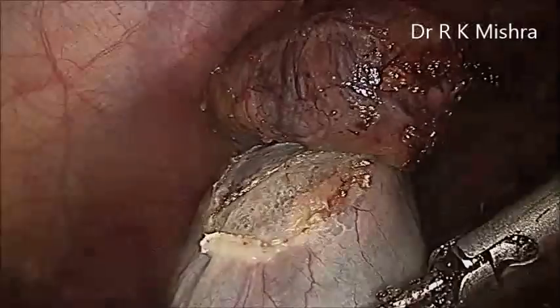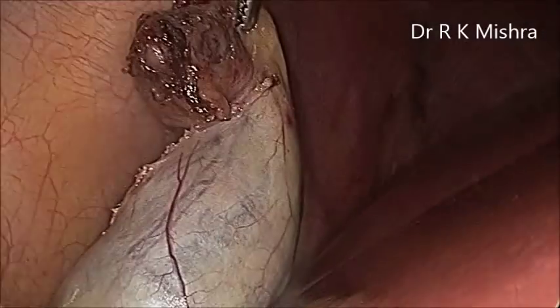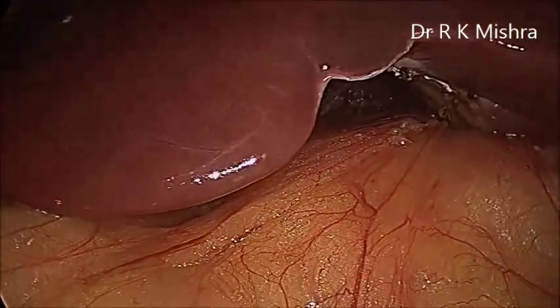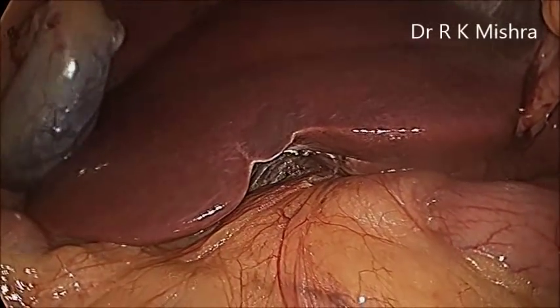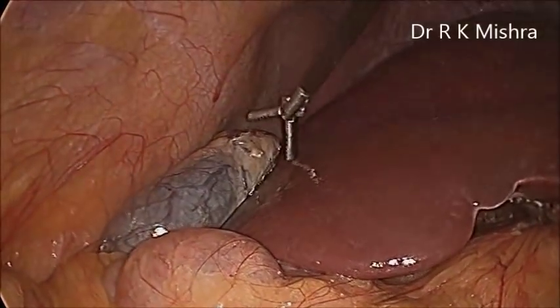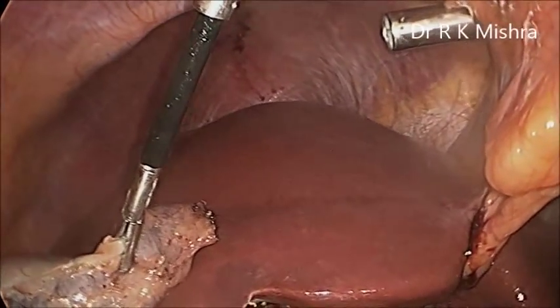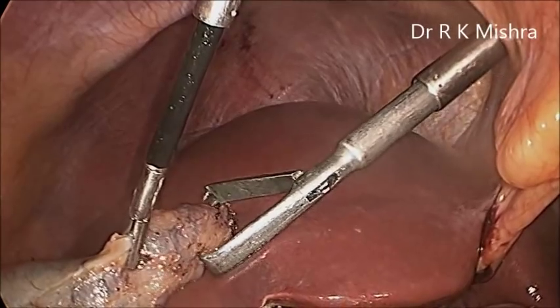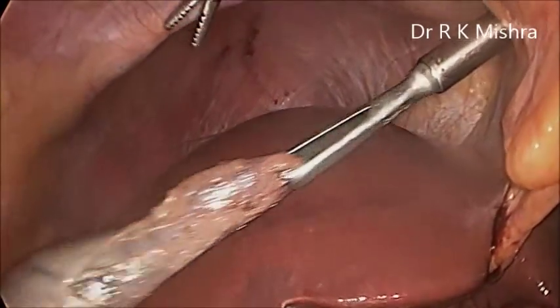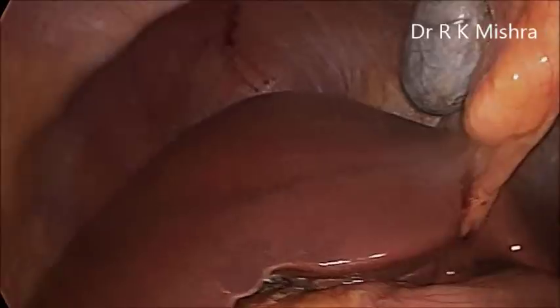Now this is the last part, and here the cholecystectomy is done. Now you should try to have one simple claw forceps, and while you are holding the neck of the gallbladder with the claw forceps, we should always take care that it should not be held transversely. We should try to hold at the part where it has been cut, so that it remains longitudinal. Here the claw forceps is coming, you can catch it, and then the neck of the gallbladder can be pulled into the cannula, and then the entire cannula can be taken out together.